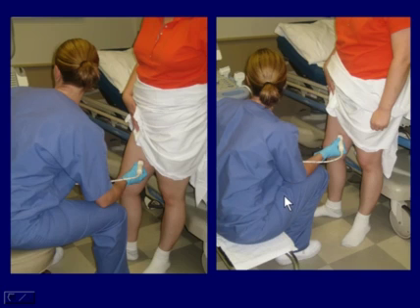A lot of people ask, how do we do this with a patient standing, and how do we get through this exam? Here we have our technologist sitting on this step stool here, and she's leaning forward, her back is bent, her neck is cocked here to the side, and she's examining the mid-thigh area in this subject. However, this is totally going to wind up with her needing a massage, if nothing else, because she's going to produce a lot of strain on her neck and shoulder and back.